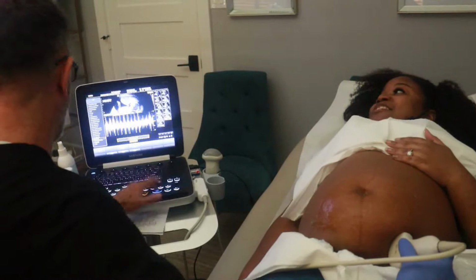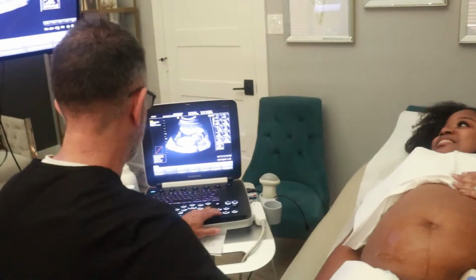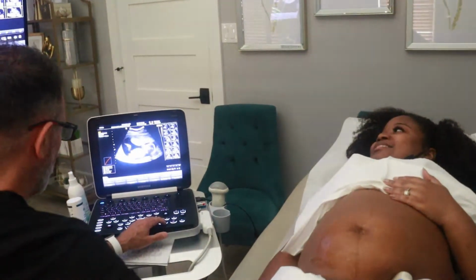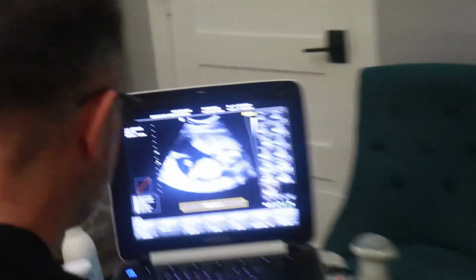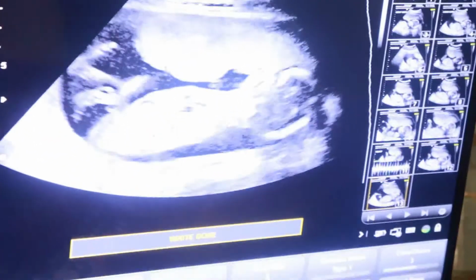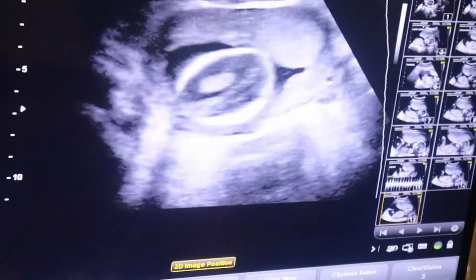Beats a minute, 160. 120 to 180 is good. That's so steady right there. Look, it's moving. Having fun in there. Being getting a lot of food. All right, so now. My baby's kicking his legs. I see it. Wiggle worm.